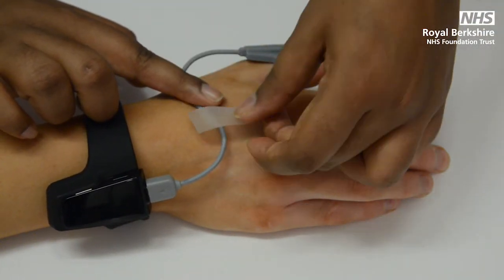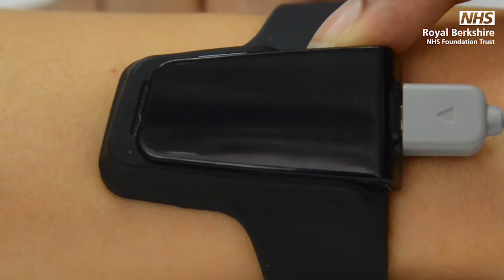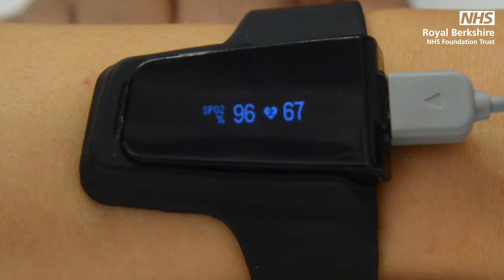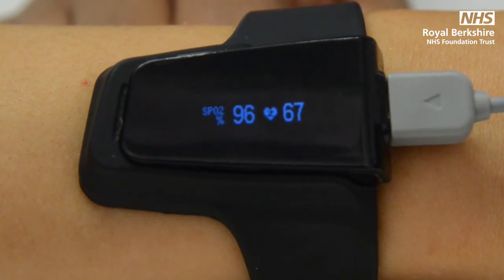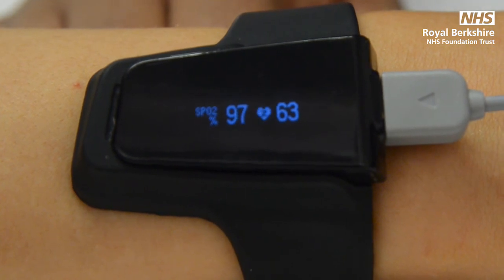Secure the wires with tape. To turn the machine on, press and hold the black button at the top of the machine until the screen lights up. After a few seconds, you should expect to see two numbers appear on the screen. If after one minute there are no numbers appearing, place the probe on a different thumb or finger, depending on which probe you have.